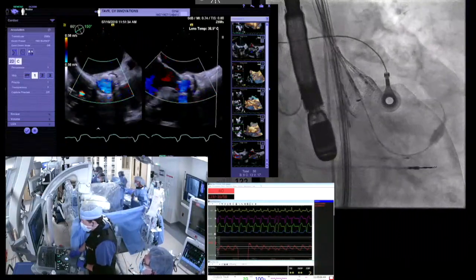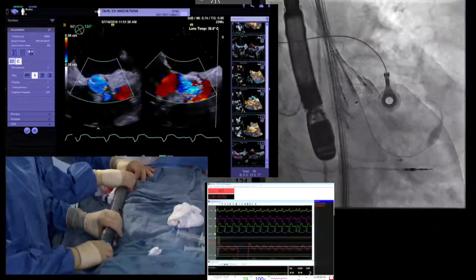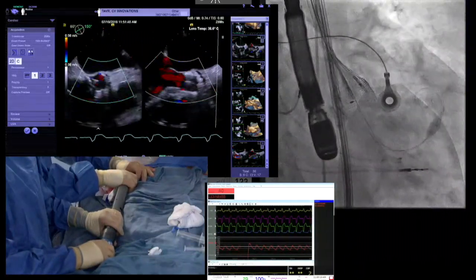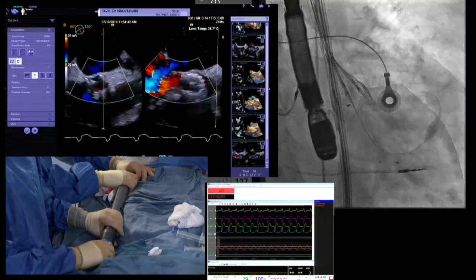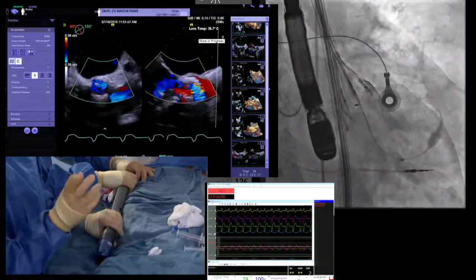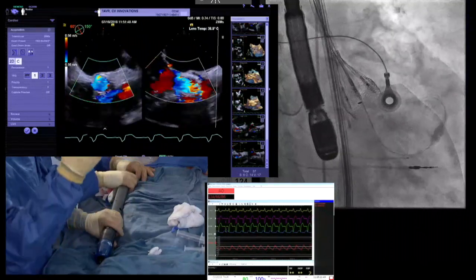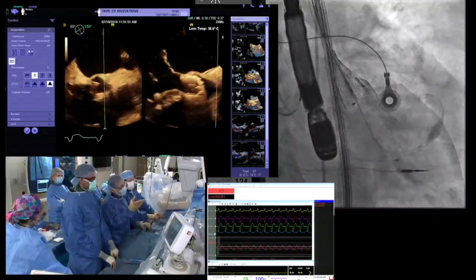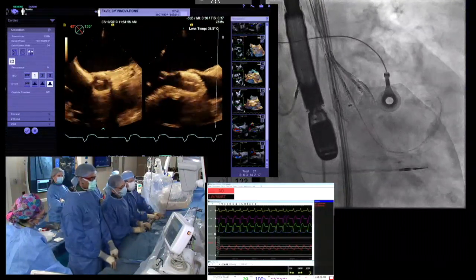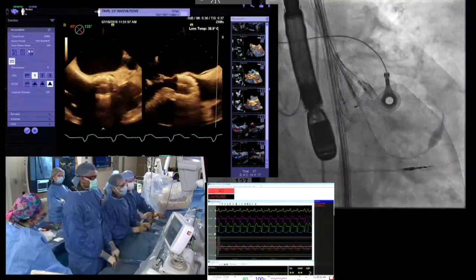And at the same time, I'm going to lean forward just to give a little energy back. Tiny bit of leak up there at about 12 o'clock, 12:30. Pretty small. That's pretty trivial right there. Not seeing a whole heck of a lot. And you see we're locked on the one side, on the left. The middle and the non-side still are not completely locked, but we've got a ways to go.